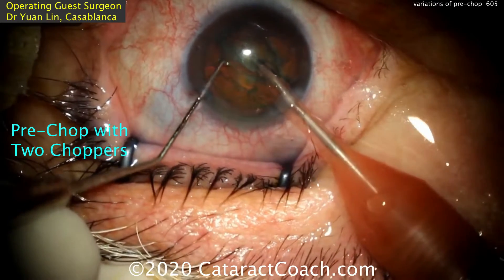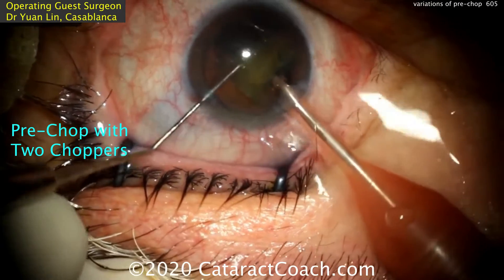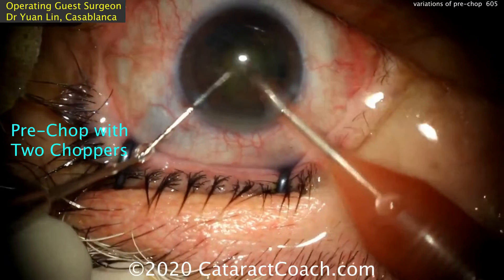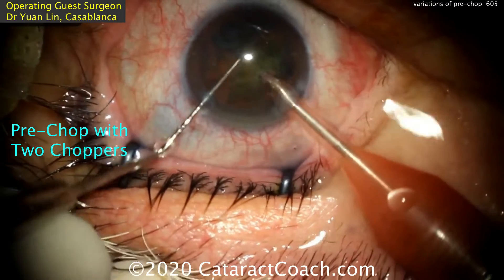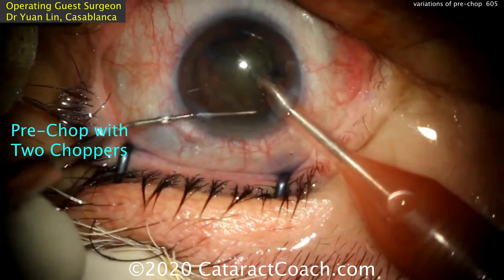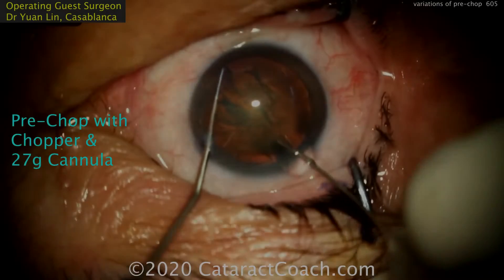We can aspirate out some of the anterior cortex, buzz into one nuclear half, and bring it up to the iris plane. The chopper goes around it and it can be sub-chopped into little pieces. So that's another type of pre-chop — pre-chop with two choppers. All pre-chop means is you chop the nucleus before sticking the phacoprobe in the eye, hence the word pre-chop.